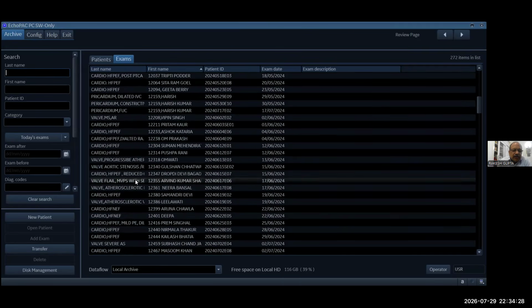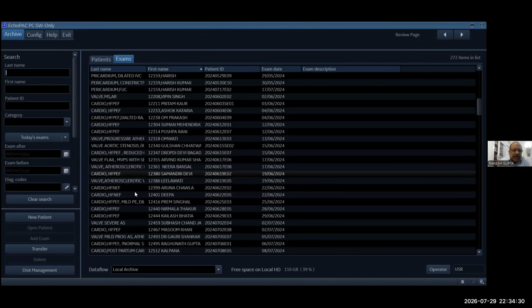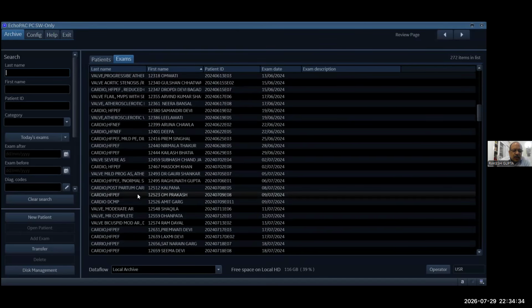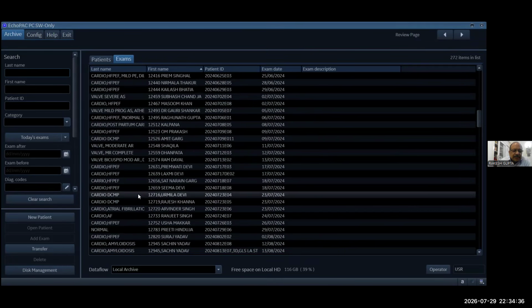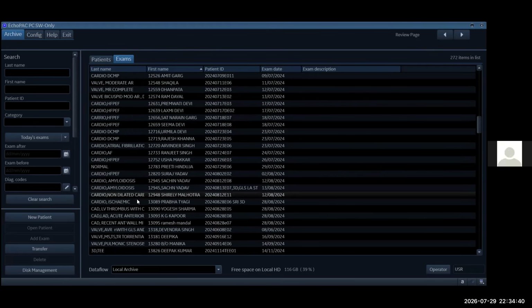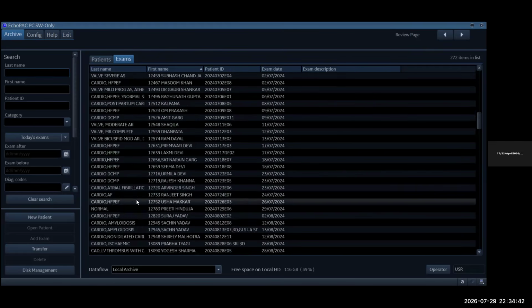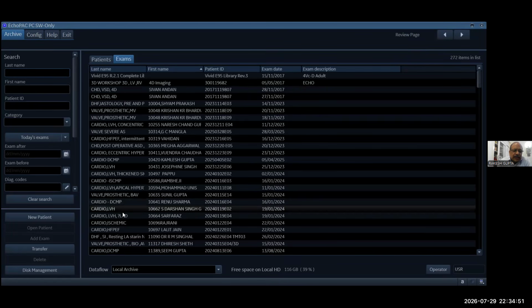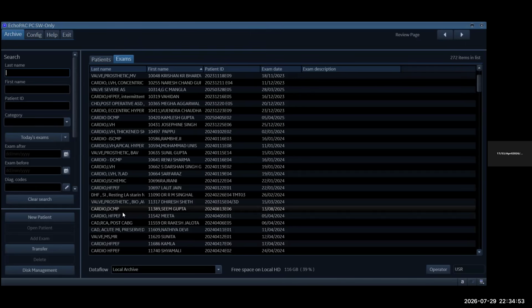When you look for wall motion, you need to look with Arjun's eye. Just look at that segment, nowhere else. Sir, if you could show some more images or clips of normal endomyocardial motion. Okay, I'm doing that only. Whatever you say, I'll do that. Thank you, sir.